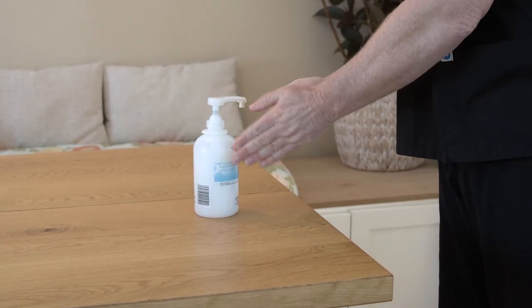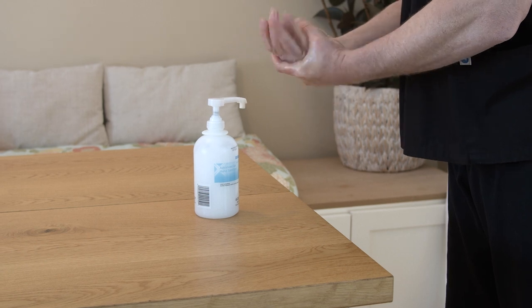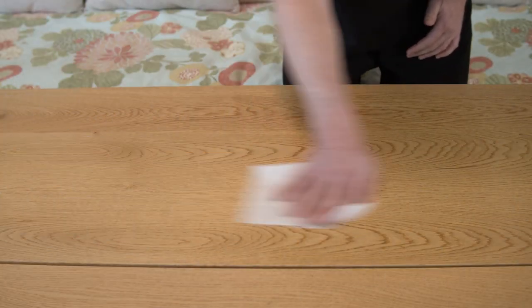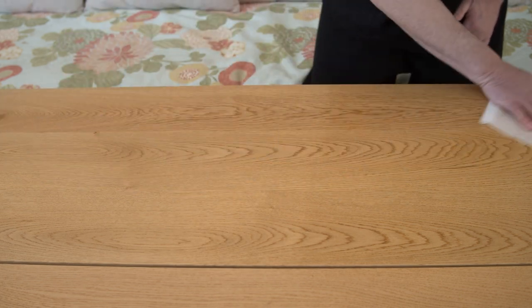To give a treatment, start by cleaning your hands with soap and water or alcohol-based hand gel. Clean your work surface with soap and water or a disinfecting wipe.